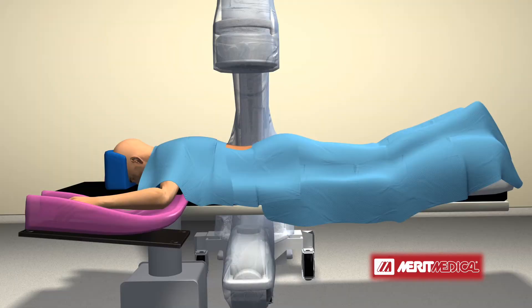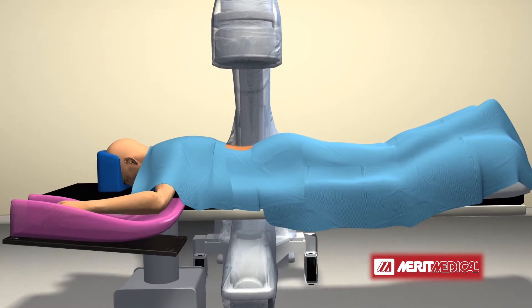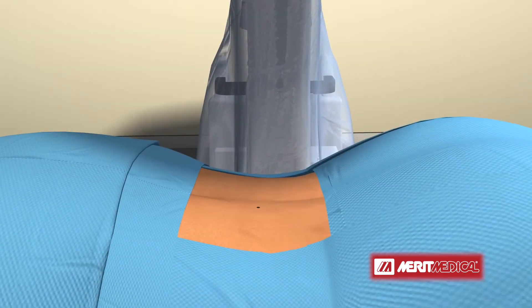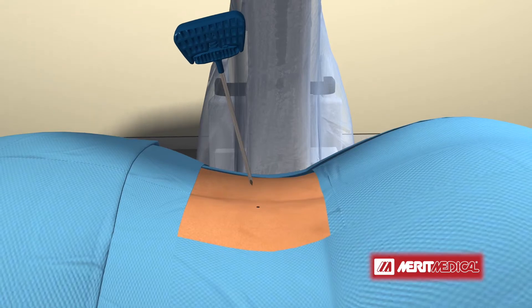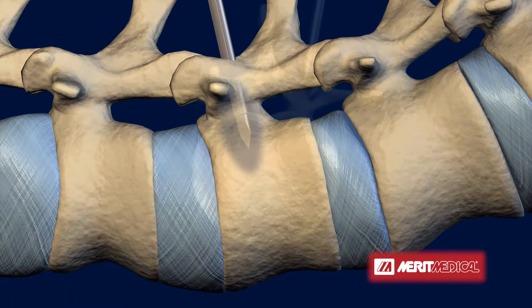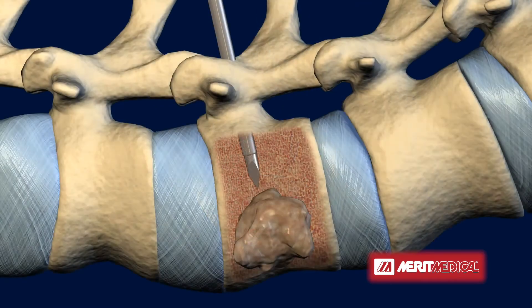With the patient under sedation in the prone position, the vertebra is accessed via a single small puncture. An introducer is then positioned in the vertebral body, providing the physician with safe access into the targeted vertebral body and the metastatic spinal tumor within it.